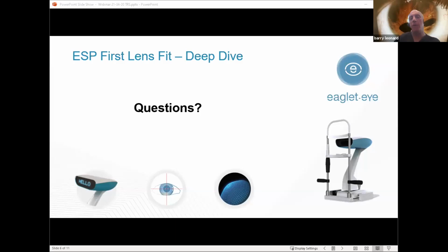Yeah, with sitting the patient down, getting everybody ready, getting all the drops, you've got 10 minutes. That's about it. And it does take two people. You have to have two techs, or myself and a tech. So there is that. But that small investment of time, with making first lens fits, more than makes up for that down the road. So I'm glad you helped me clarify.